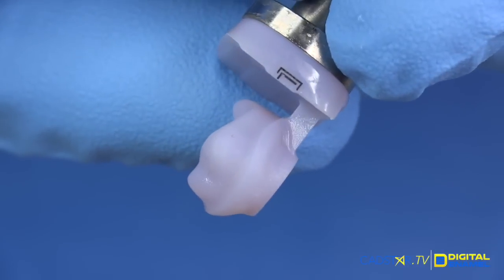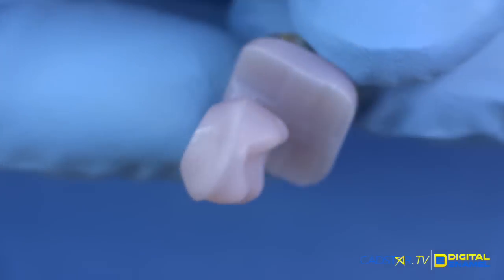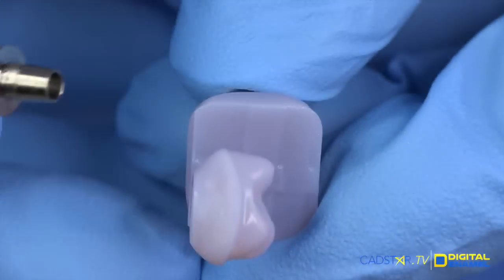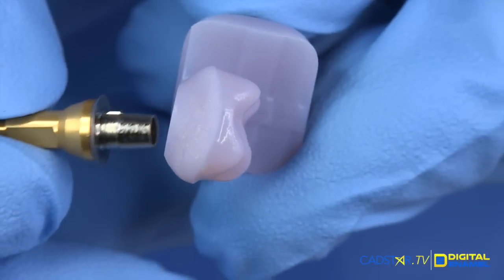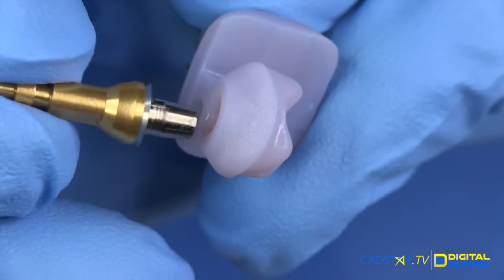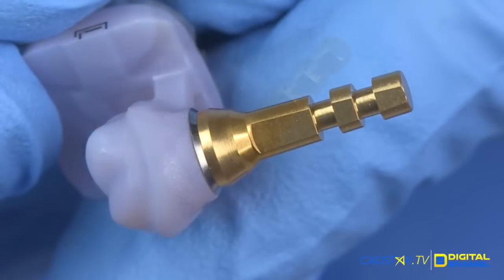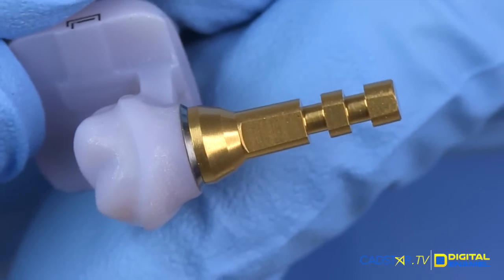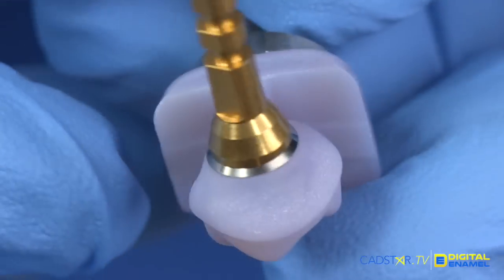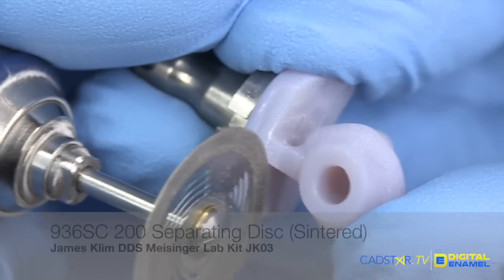This is exciting. Out of the milling unit, we see a really well refined abutment mill. First thing I'm going to do is try the tie base — make sure everything fits well, and it always does. You do want to check to make sure you have the right tie base here. Look how well this fits. That screw access hole where the tie base fits is already pre-milled, and that's in the block.